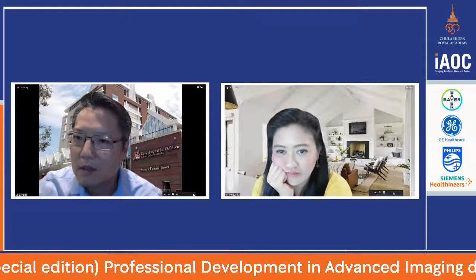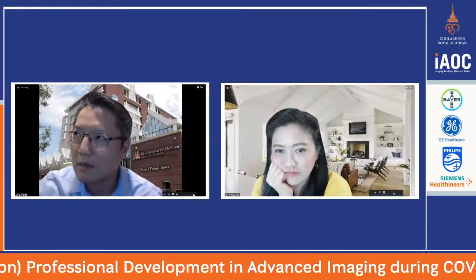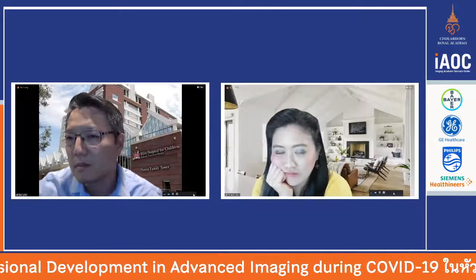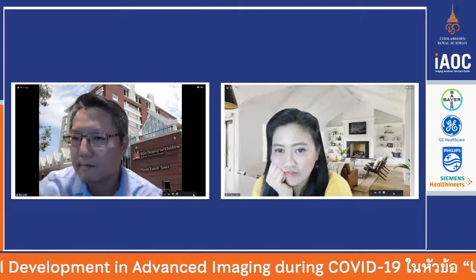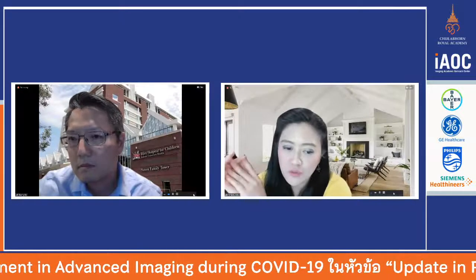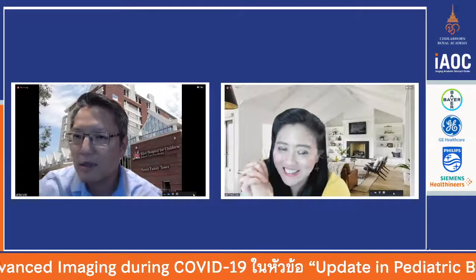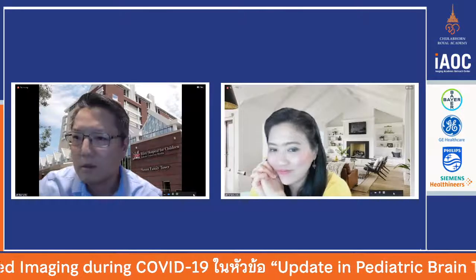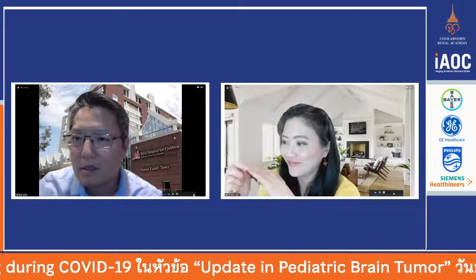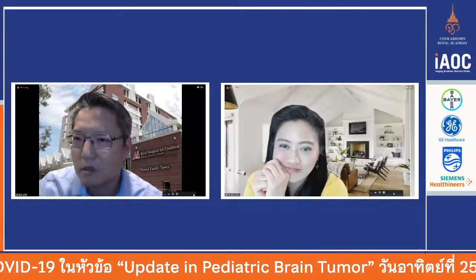You could do that, but it really requires really good post-processing software that can give you real numbers instead of just looking at the spectra. So maybe spectroscopy is not that useful. Yeah, I don't think it's as useful clinically. In the research realm you can maybe pick up even more metabolites that would be more specific to a tumor subtype, but again, that's more research than clinical.